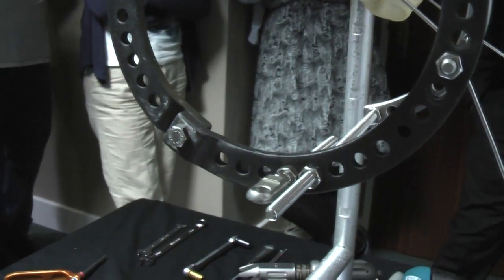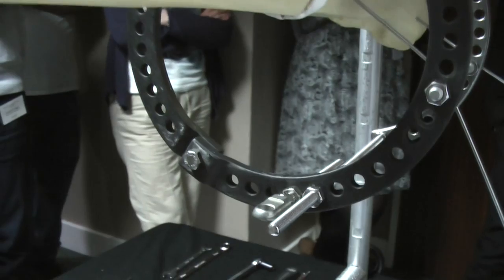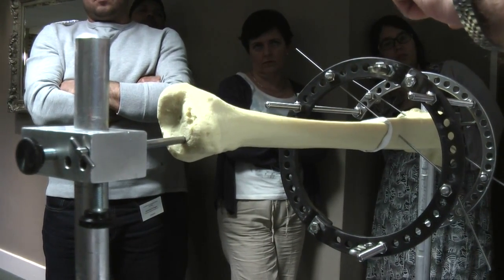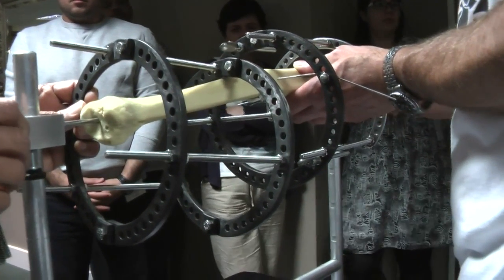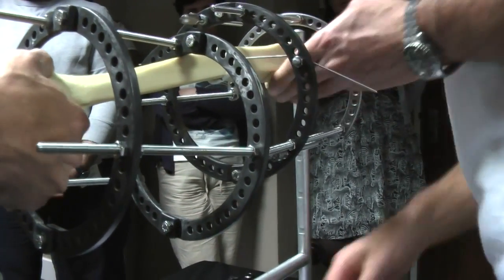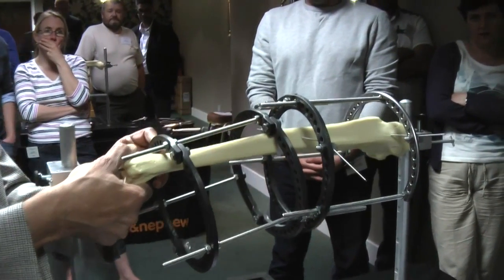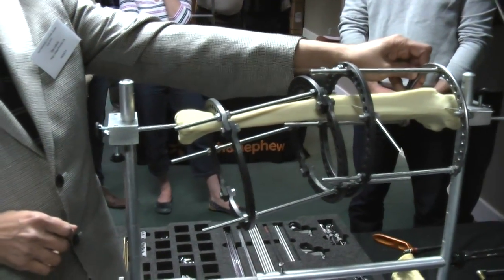But that is basically the top half of the frame. What we need to build now is an identical bottom half of the frame, which is exactly collinear with that segment down there. So it lines up exactly the same in the AP and the lateral view as this one does in the AP. And then, just like we did at the top, we're now going to put in a distal reference wire, which is going to be, just like the top one, through the tibia, at the level of the distal fibula, parallel to the ankle joint, and parallel to the ground.